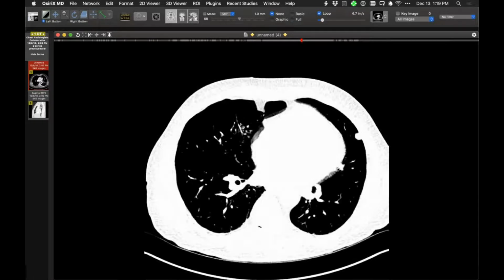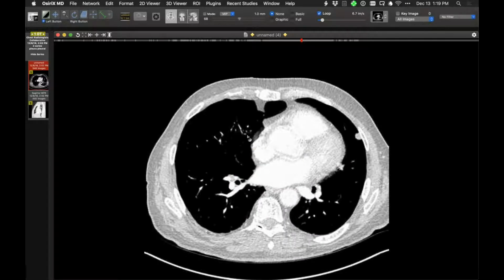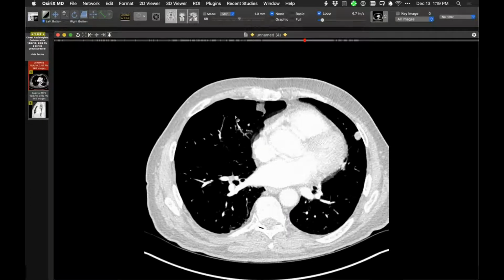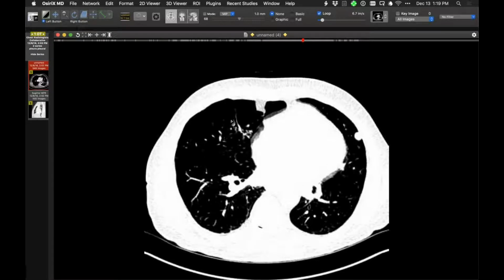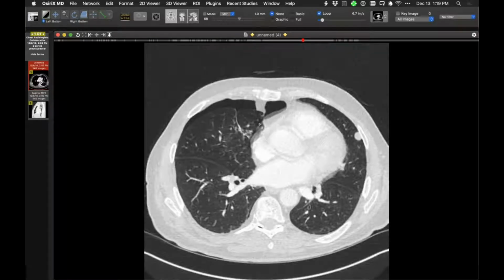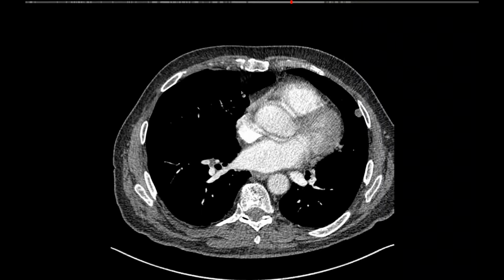So, Howard, I have seen something like this, and what's happening is that there's a little bit of a pleural adhesion there. So the visceral pleura of the lung is attached to the parietal pleura of the chest wall. Then when the lung is collapsed here, it's actually pulling on that parietal pleura, which is fairly stretchy. The parietal pleura is right there. There's a fusion right there. And so basically the parietal pleura is being pulled inward from the chest wall, and it's very stretchy, and the fat is just following.